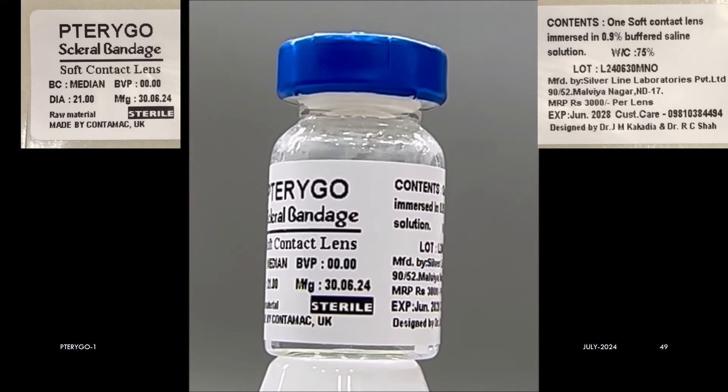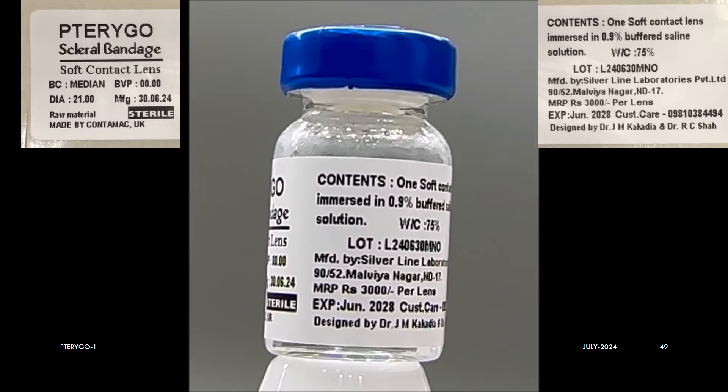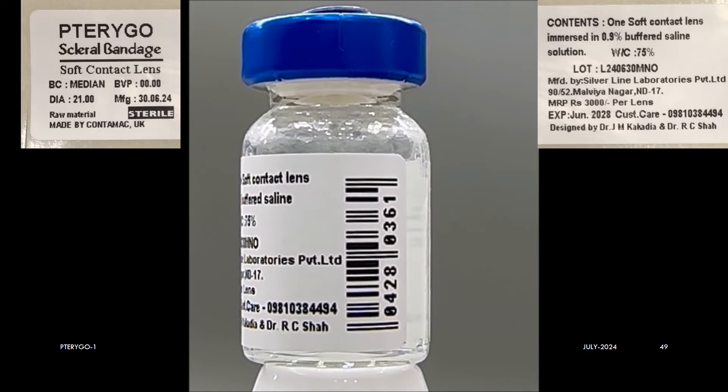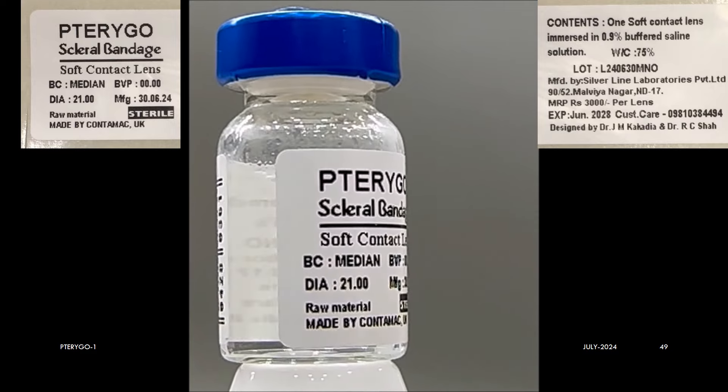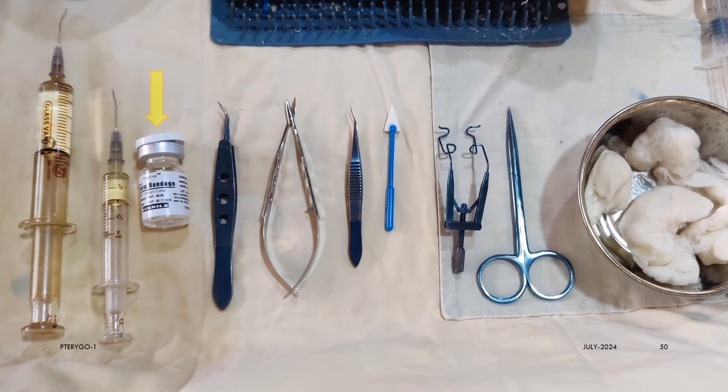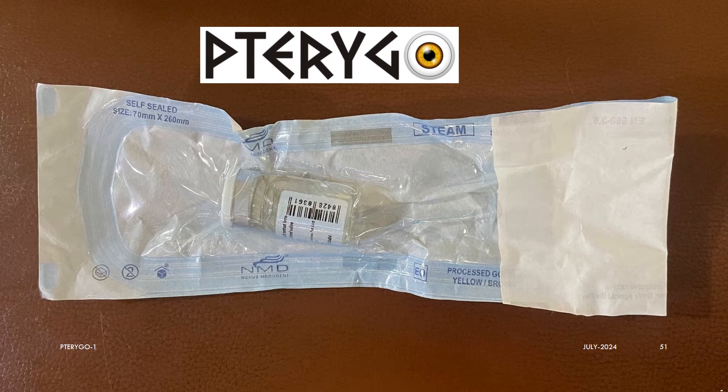The lens is available in a wide-mouth glass bottle sterilized by autoclaving at manufacturing, so the inner contents are already sterile. It is made by Silver Line Laboratories, New Delhi, India. Although the inner contents are sterile, we autoclave the whole bottle after packing it in layers of linen in the autoclave drum so that the outer surface is also sterile. The material of this lens can be autoclaved many many times. In the near future, the Pterygo lens will be available in pre-sterile pouches, but at present it is best to autoclave the whole bottle.